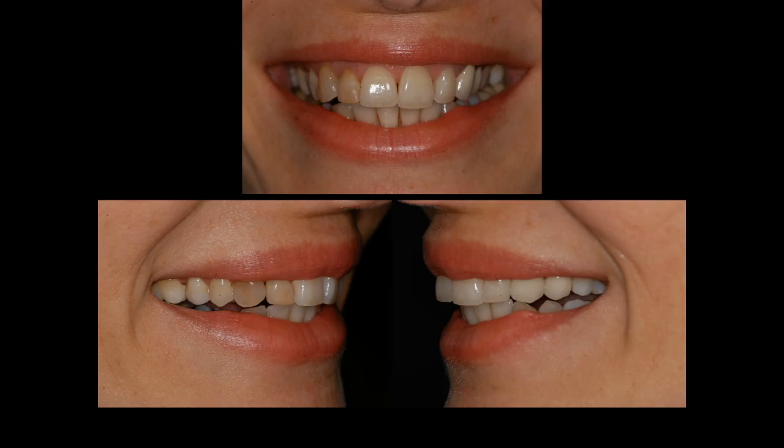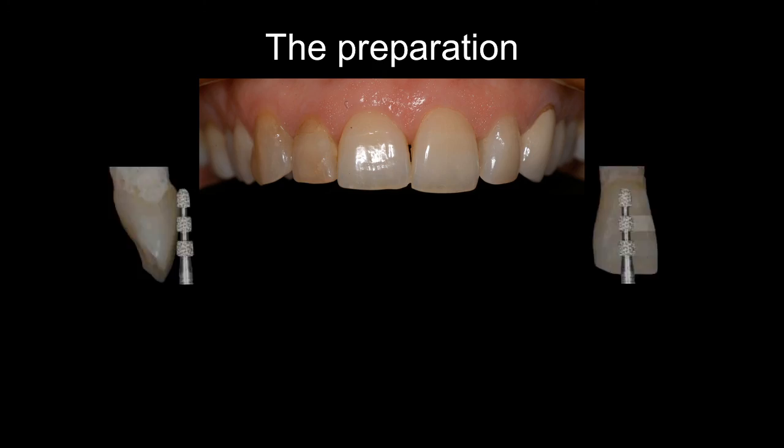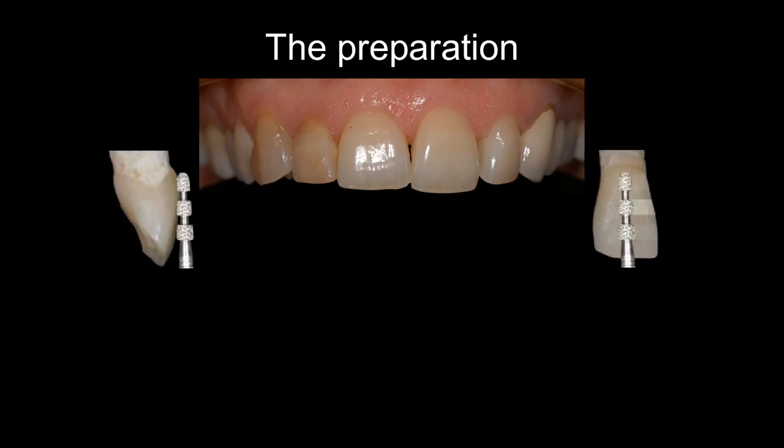When we talk about veneers, veneers cannot easily cover discolored teeth. When you have teeth with root canal, and this is the teeth of a colleague dentist, she refused to have crowns on her teeth, and she had endodontic treatment. Are we keeping the size of the teeth? Yes, we are. Are we going to prepare? We will definitely prepare if we're going to keep the teeth in their position. What was advisable in this situation? Knowing that if we're going to keep the size, we're going to prepare the tooth. If we're going to prepare the tooth, we're going to remove the enamel.